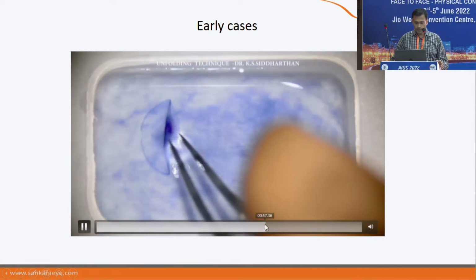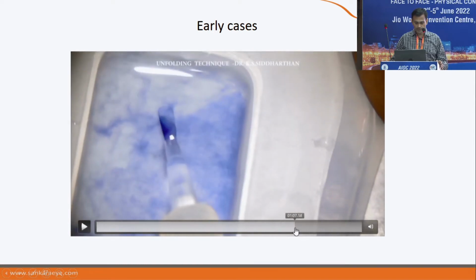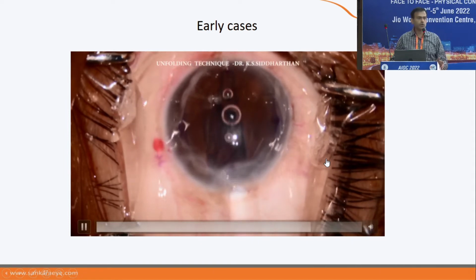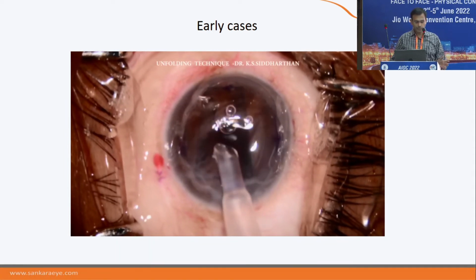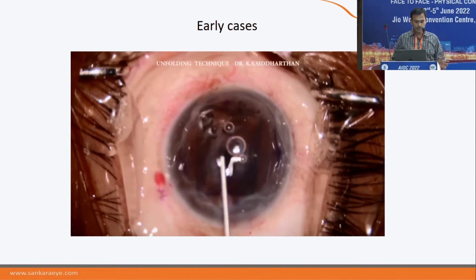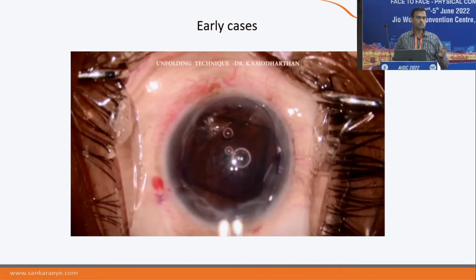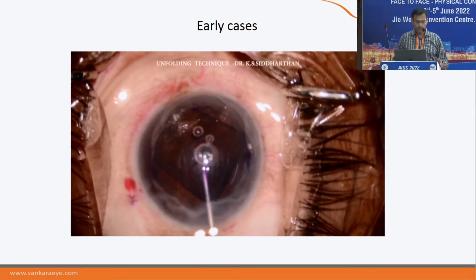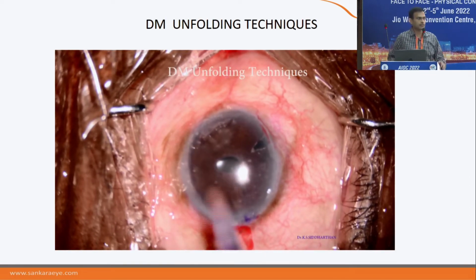When you take an elderly tissue, you can see that it very beautifully unfolds inside. You don't need to manipulate, and your confidence level is higher. You see here, even before putting a suture, I am giving a few taps and it opens up. So use elderly tissue. Keep in mind to use tissue above 55 to 60-65 years when you start, so that you are comfortable to unfold.